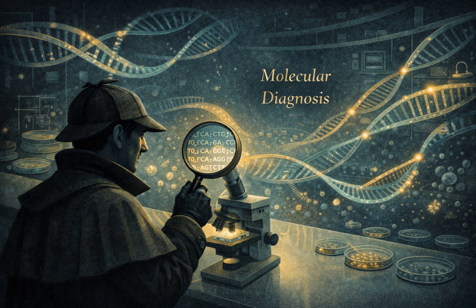Now, 16S identifies the species. But sometimes, in an outbreak, we need to go deeper. We need to know if the salmonella making people sick from lettuce in California is the exact same strain as the one popping up in New York. For that, we need whole genome sequencing, WGS. WGS is the heavy artillery of public health and epidemiology.